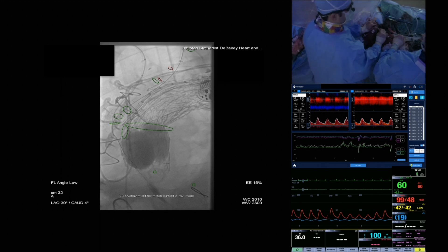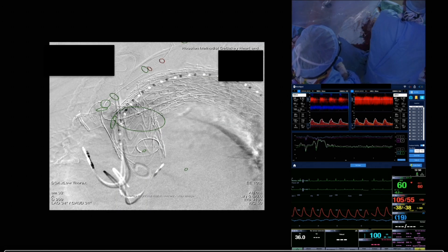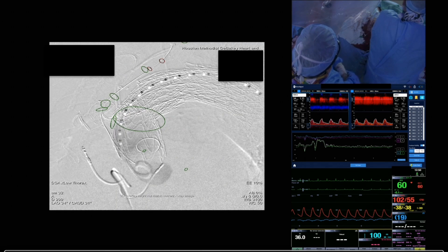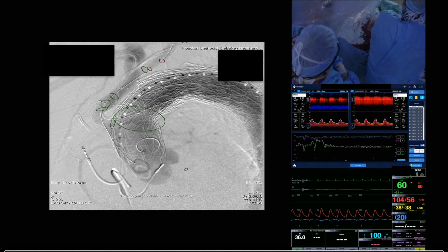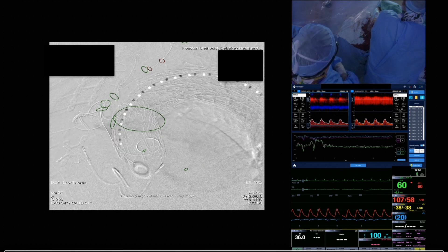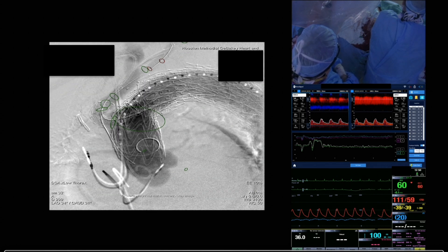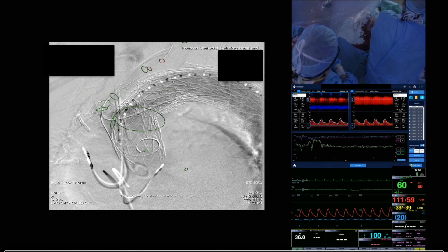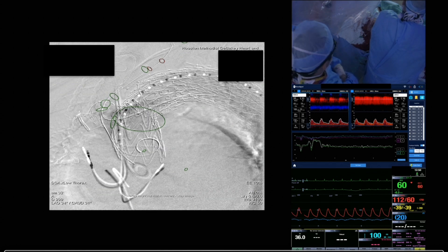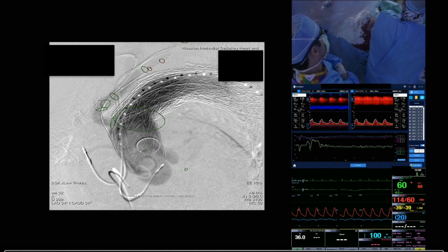After the balloon deflates, velocities and waveform return to normal. The final angiogram shows good flow and patency of the important side branches, which correlates with what we see on our TCD monitor — good mean flow velocity and regular waveforms. The resolution of the endoleak has also been confirmed with the angiogram.